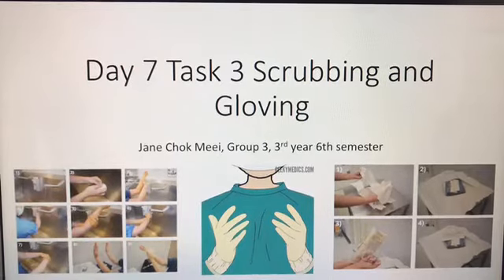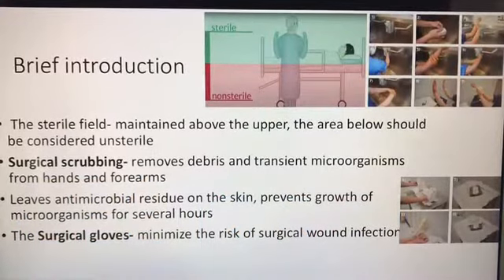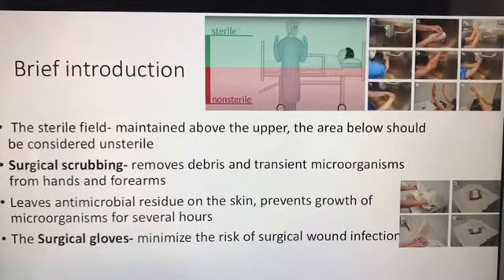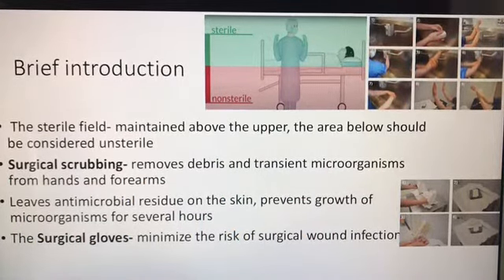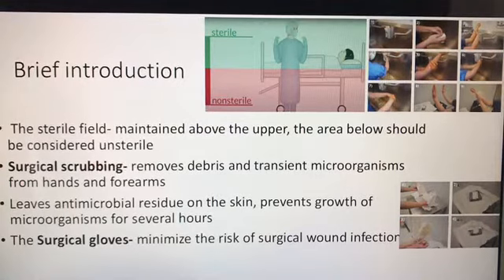Today, we'll be discussing scrubbing and gloving. Before getting into it, a little brief introduction to start off. The sterile field should be maintained above the upper abdomen of the person in the sterile gown. The area below should be considered unsterile.